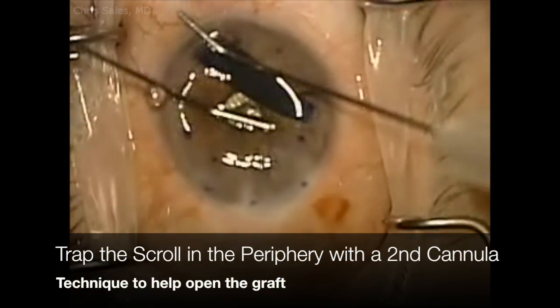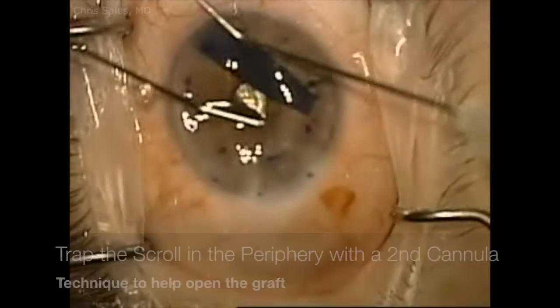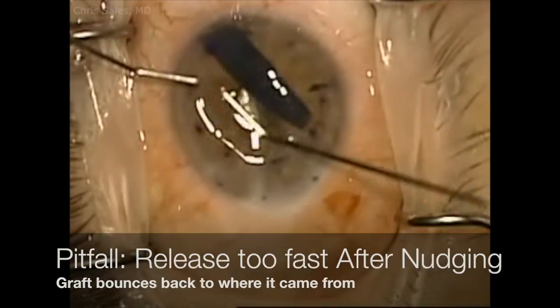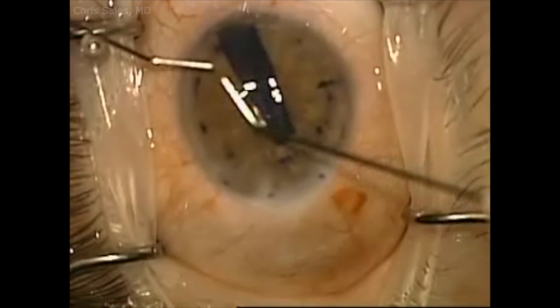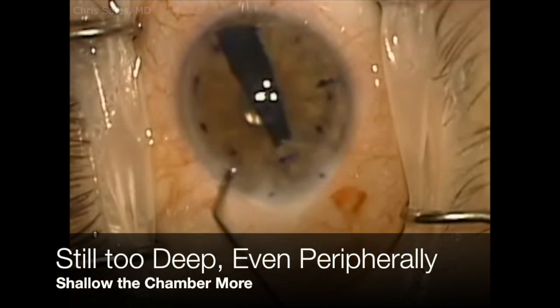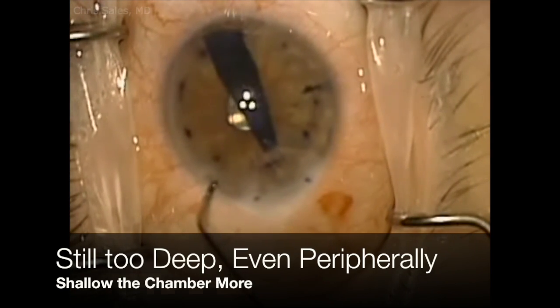Here I try and block the scroll into the most peripheral part of the chamber where it's more shallow and tap on one end of the scroll again, but it's not working. I try and nudge the scroll but I release too quickly so it bounces back. The chamber is too deep so I go ahead and shallow the chamber even more.